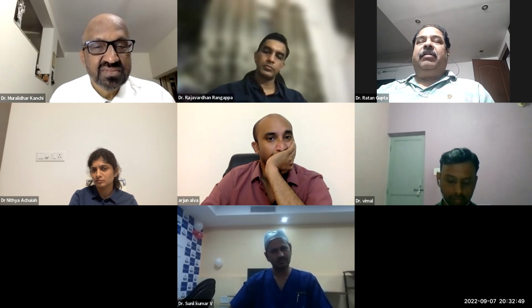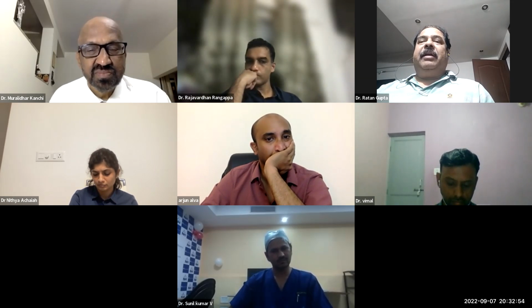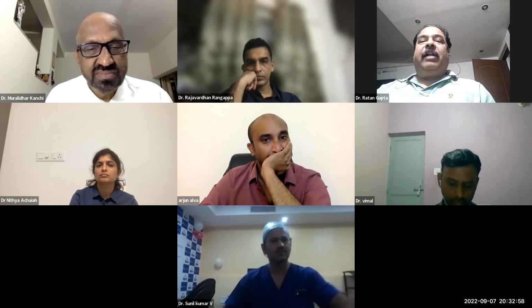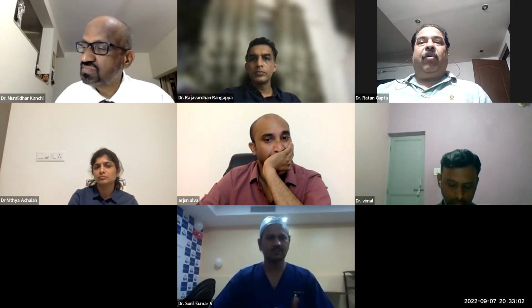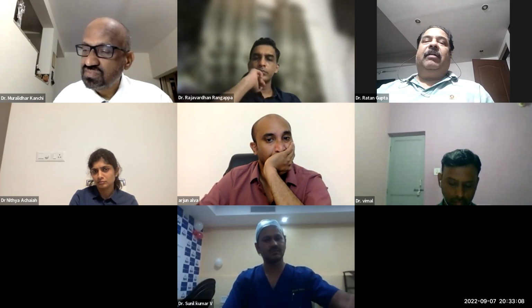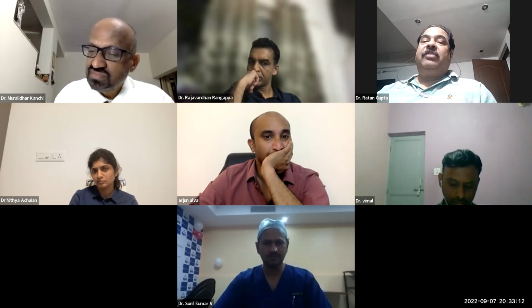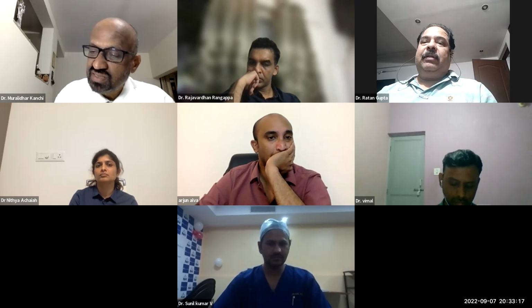Whereas when the patient is not on ECMO, any secretions, anything can significantly drop the oxygenation, and you don't have that kind of a safety margin when the patient is not on ECMO. So probably that gives you the courage to keep the FiO2 on the low side and target the saturation around less than 90, which you don't do on patients who are just on ventilator and not on ECMO. Yes, yes. Any other responses?